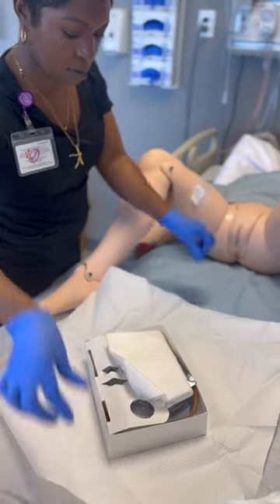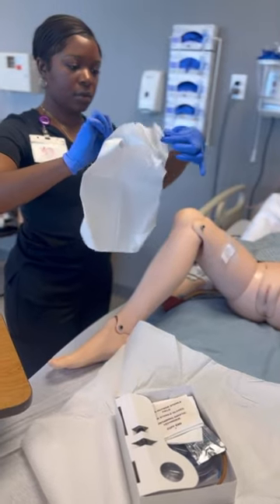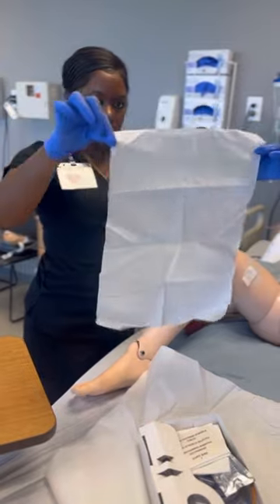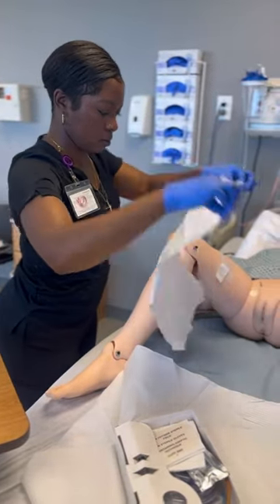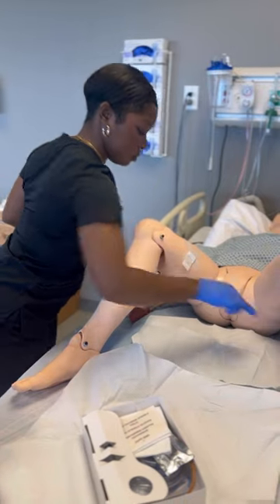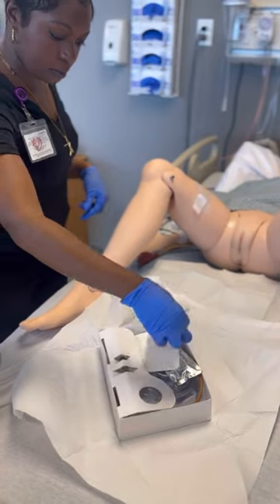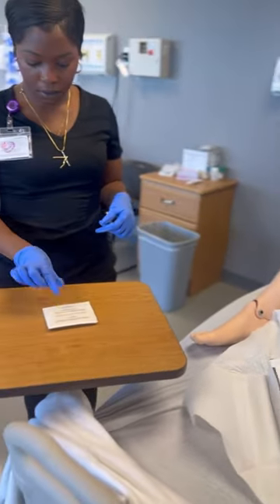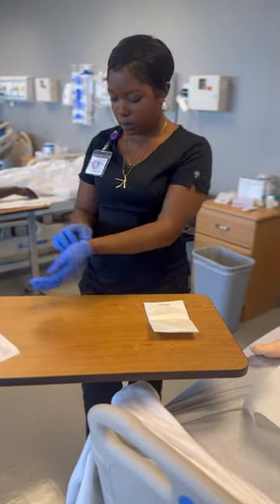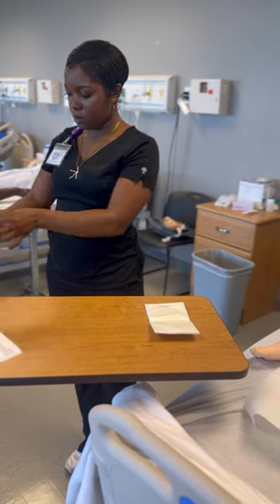Remember that you have a one-inch border around your sterile field that is considered unsterile — that's the part you can touch. With clean hands or clean gloves, touch the one-inch border and put the drape shiny side down. Be mindful that when adjusting the drape you are only allowed to touch that one-inch border. Now grab your sterile gloves out of the kit and open them on the table, making sure you do not turn your back on the sterile field.